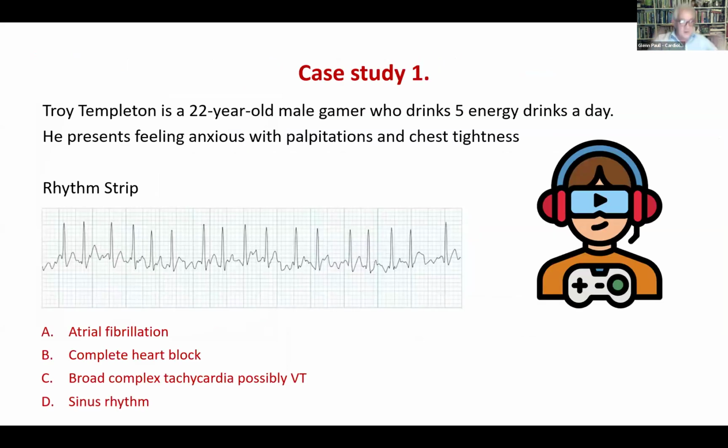So that's a little bit of an overview of just ECG, how to take an ECG, looking at the ischemia and infarction features, looking at some common arrhythmia. The most common one you're going to see is atrial fibrillation, irregular. People need to be rate controlled and on anticoagulation to prevent stroke, because it is a leading cause of stroke.